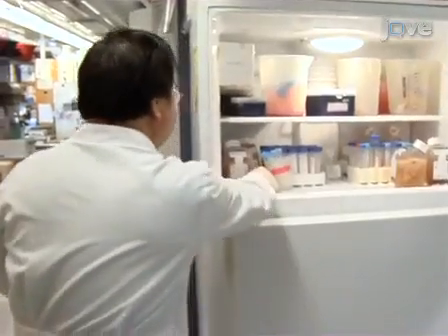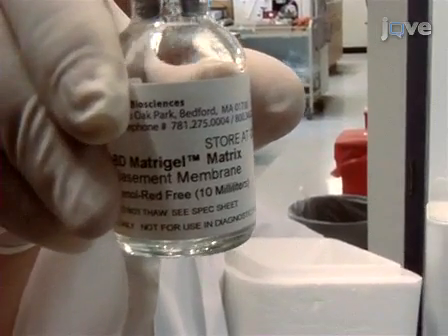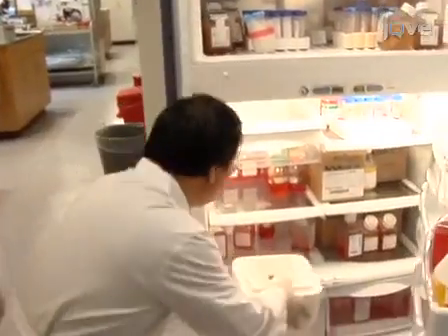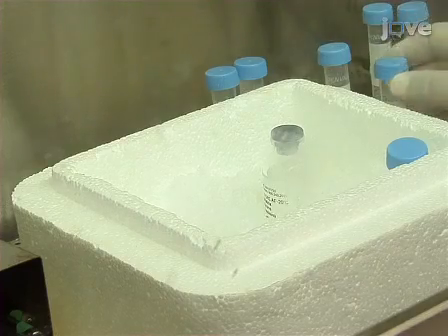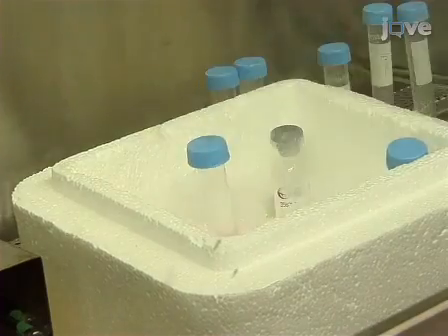The day before establishing the co-cultures, remove the matrigel from the freezer and thaw it on ice in a 4°C refrigerator overnight. On the day of the experiment, place the culture medium on ice at least 1 hour prior to mixing it with the matrigel.